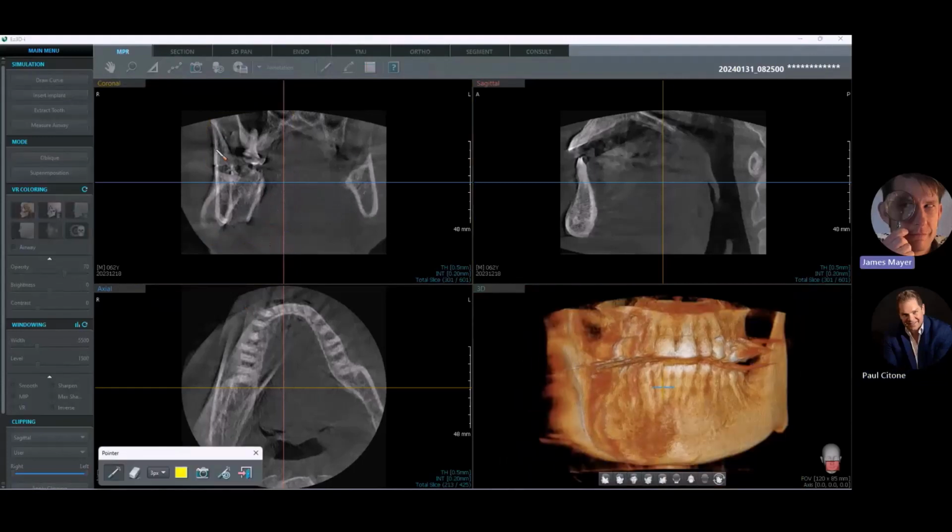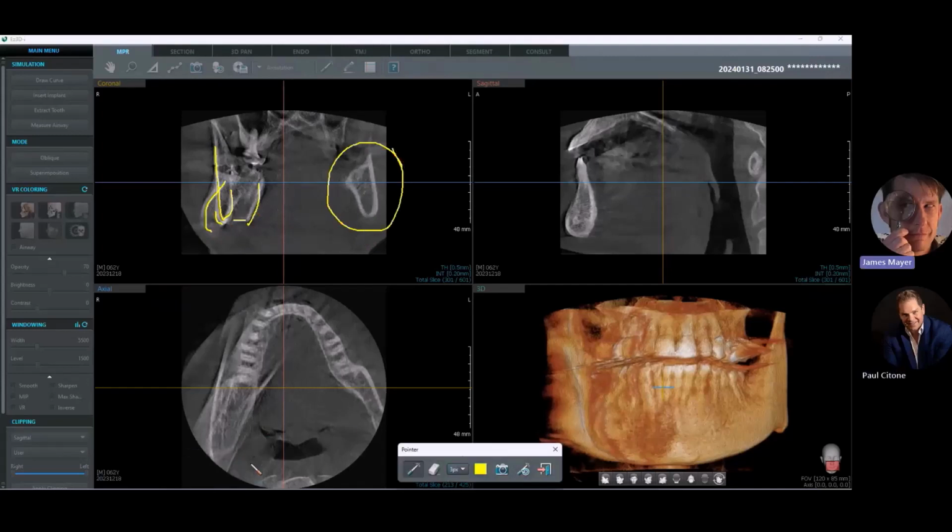Yeah, I agree. So I'm following the ramus down here, and then as you described, here's another ghosting, so you can see a lot of ghosting through here, whereas we look on the patient's left side, look how clear it is here, which is also translated in the mandible, patient's right side versus the left side here. Yep. So that's a very good example of looking and recognizing patient movement within a scan.